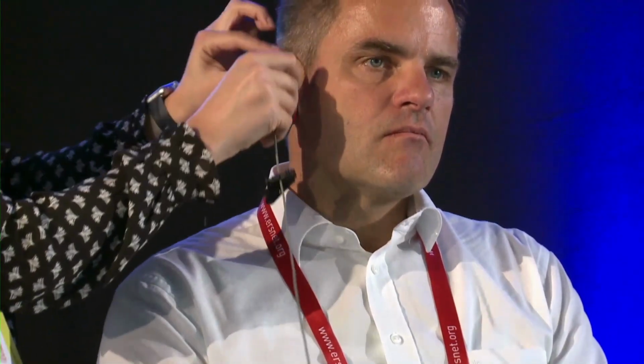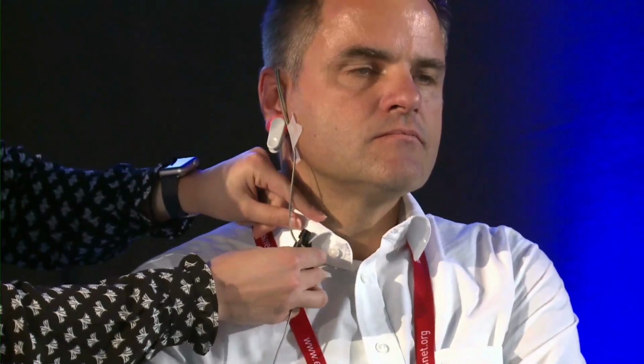Once we have put the gel on, just pull on the earlobe so that we avoid wrinkles. Pull on the earlobe and attach the ring. We always recommend doing one or two loops with the cable around the ear, so that the sensor stays in place and is secured. Additionally, we recommend using a tape, put that on the cheek. Perfect. So this is one measurement site, and you can do both. You could place the sensor behind the earlobe or in front of the earlobe. Both positions are possible, whichever the patient is more comfortable with.